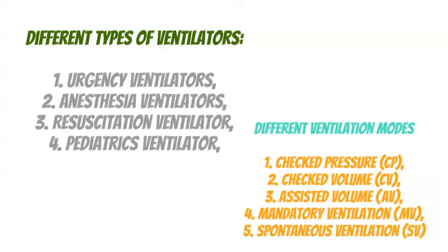This mode is applied for patients who suffer an injury at the level of the tracheal tube or lungs, or who suffer from asthma. In controlled volume mode, the ventilator works with preset volume, output, and frequency. The objective of this mode is to allow controlled volume ventilation, supply a preset volume and frequency, and supply a controlled inspiration duration. The application of this mode is to support patients with normal lungs or patients in post-operative care.